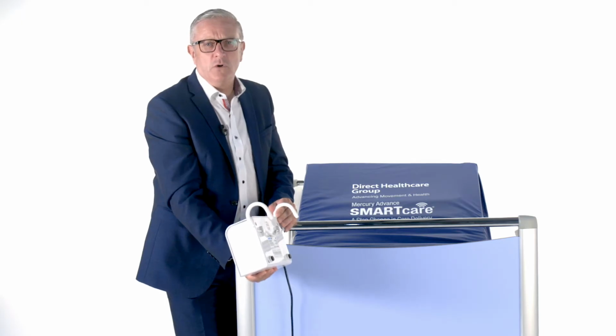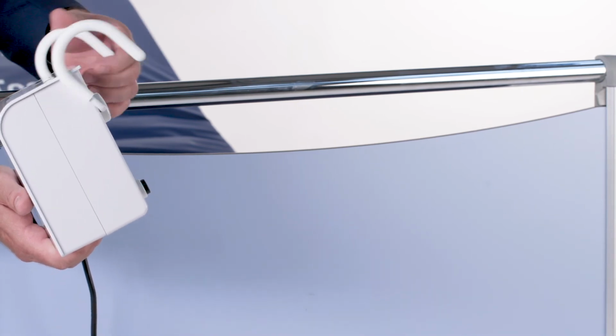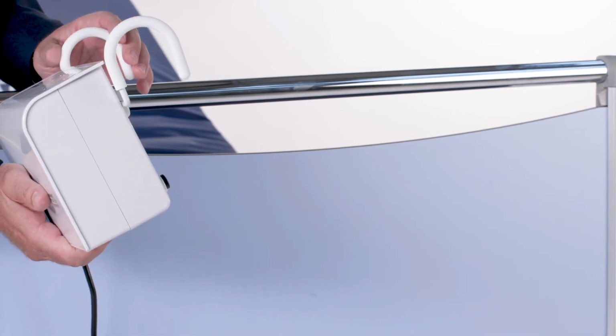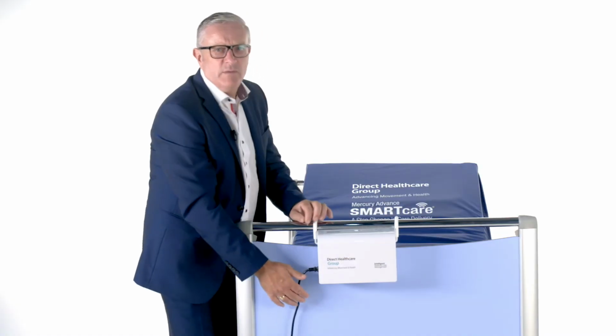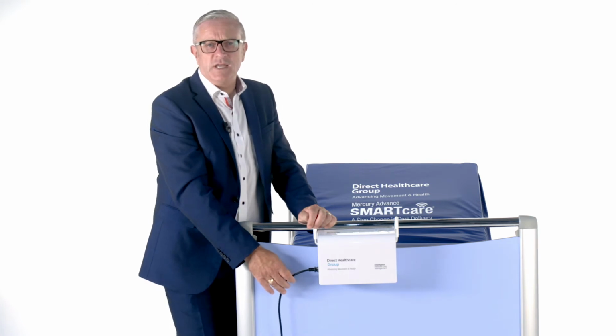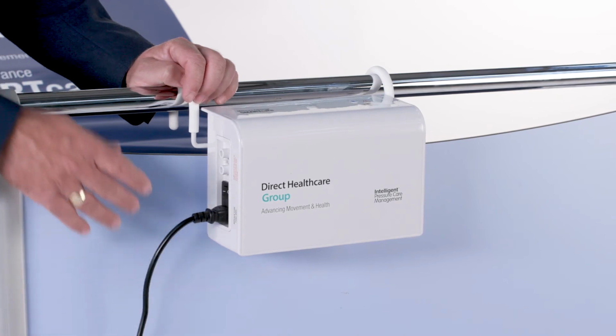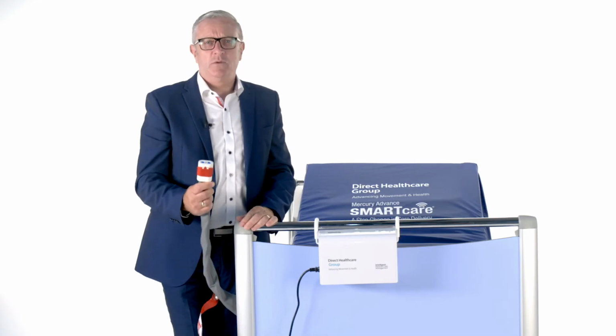The pump can be hung from the foot end of the bed frame using the white hooks that swivel out. Ensure that the pump is safely secure and does not pose a hazard. The mains lead can then be plugged into the main socket, ensuring that any trailing cables are appropriately managed for safety. Next, we take the umbilical and attach the connector to the pump with the quick release function facing you.